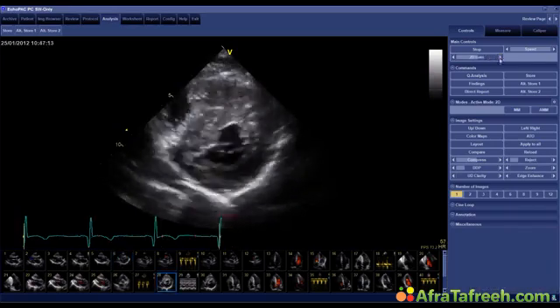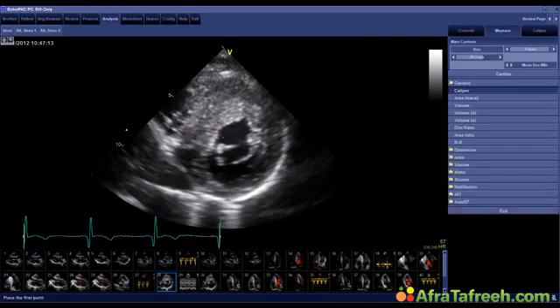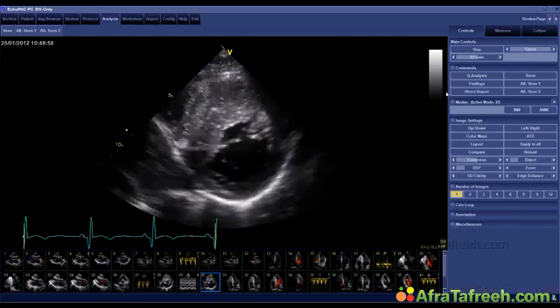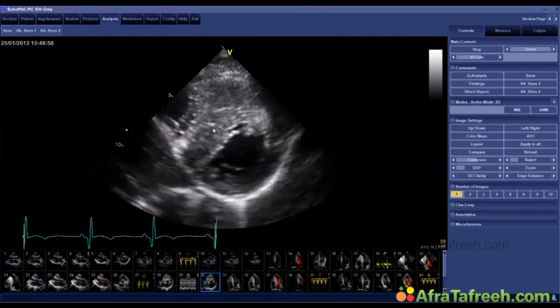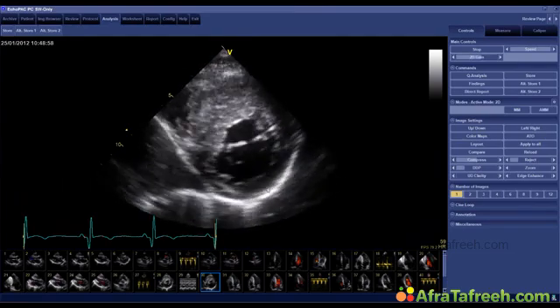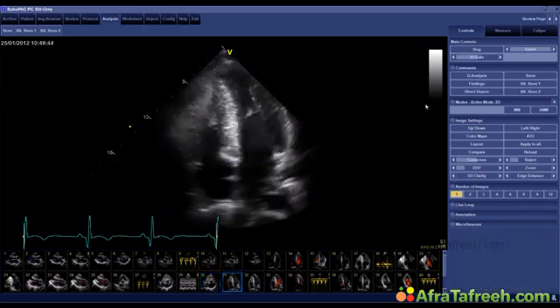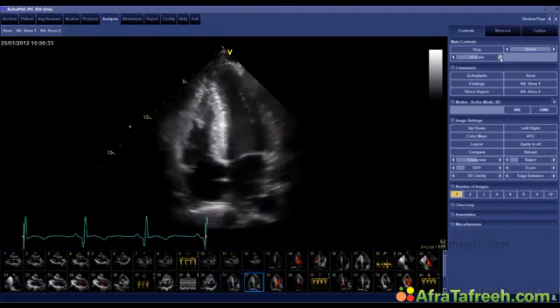I'll just give you a better view here. Okay, I'll measure the thickness of the septum. This is 26 millimeters, and in some regions we even found a thickness close to or even above 30 millimeters. The next thing you see is that the hypertrophy is very abnormal. We have an almost normal thickness of the posterolateral wall, so asymmetric left ventricular hypertrophy. This is the 4 chamber view actually. Yeah, this is probably a nicer view.